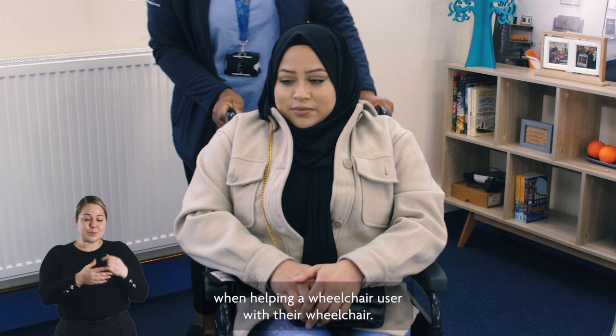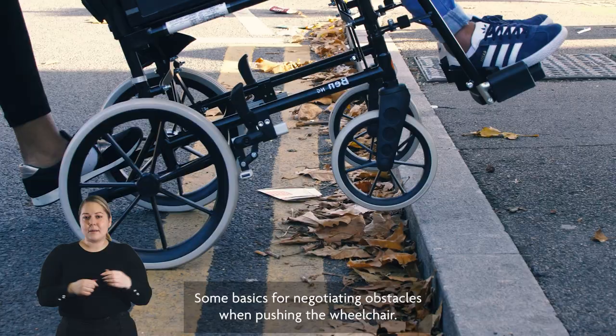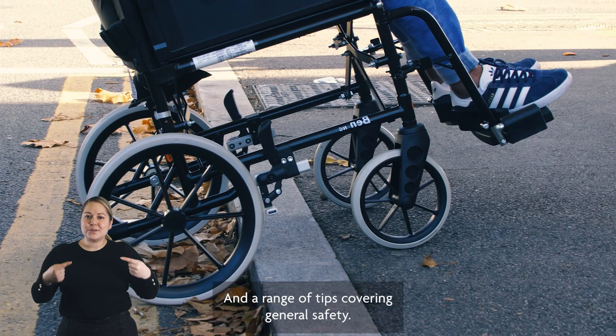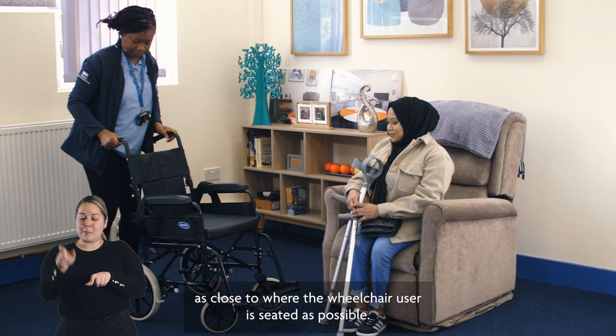In this video we'll run through some of the basic things that you need to know when helping a wheelchair user with their wheelchair, including how to assist them with getting into and out of the wheelchair, some basics for negotiating obstacles when pushing the wheelchair, and a range of tips covering general safety.